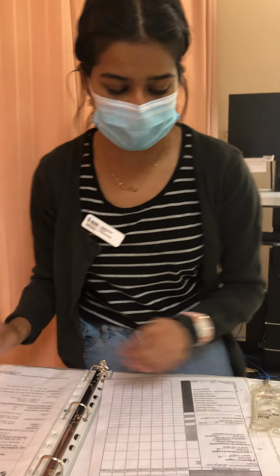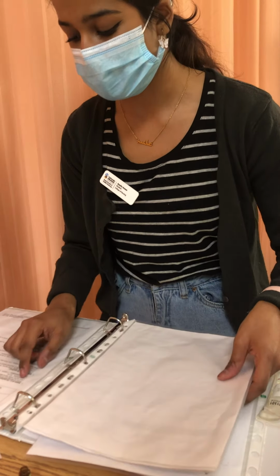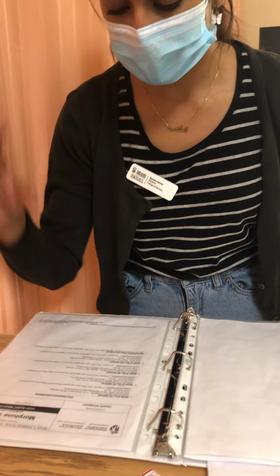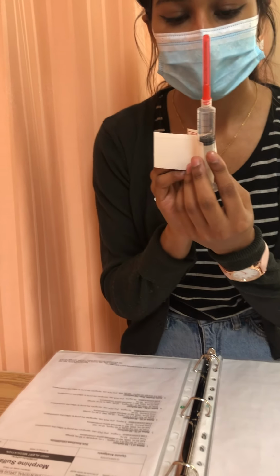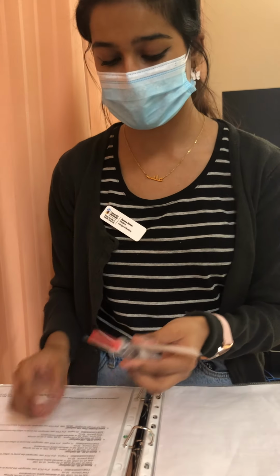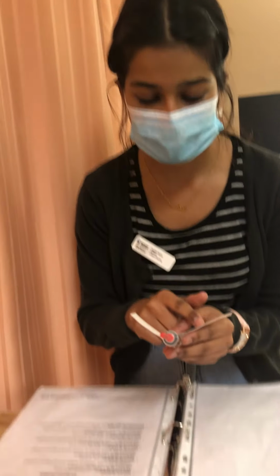Perfect. So I have morphine drawn up. I have the right dose of 1 milligram per ml, 1 milligram as a bolus dose, and according to my PDM, we drew up 50 milligrams of the medication, which came in 1 mil ampules with the concentration of 10 milligrams per ml. So we drew them up from 5 of these ampules. So I'm going to double check to see if I have the right dose. So we have 5 mils in this syringe, and I have it written over here as well. So we have 50 milligrams, and we have 5 mils into the syringe.